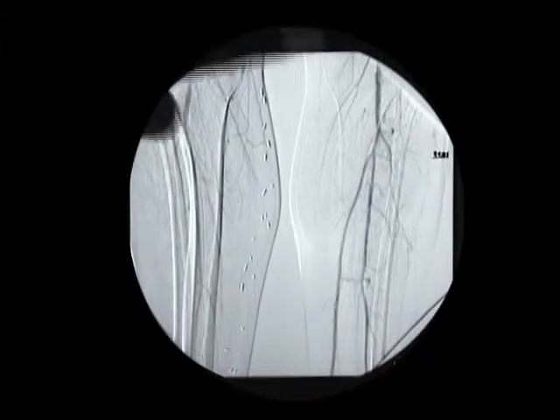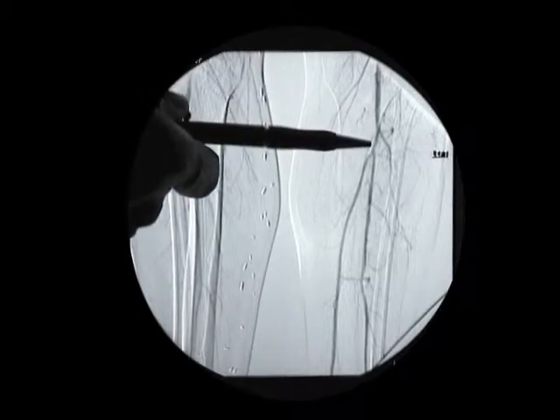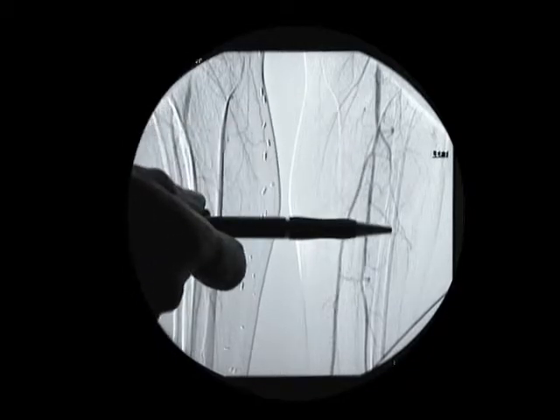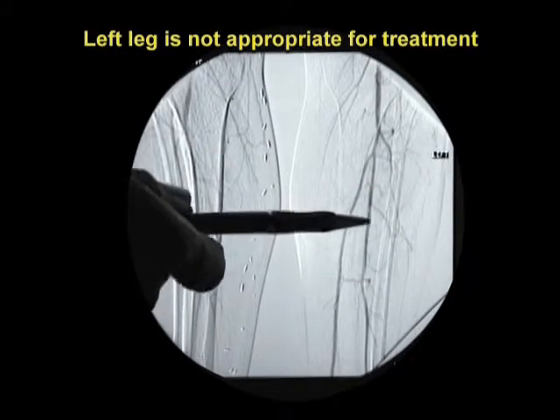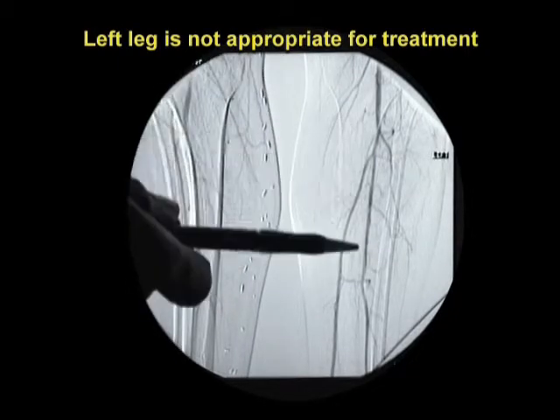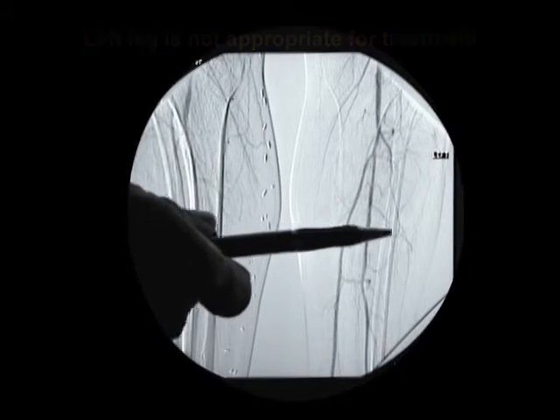On the left side, we see the below knee popliteal artery is of quite good quality. The tibial-peroneal trunk is patent, and there is nice two-vessel runoff through the peroneal and posterior tibial artery. The anterior tibial artery, however, occludes. The anatomy seen on this left side would not typically be appropriate for inclusion in this trial, as a femoral to below knee popliteal bypass would be a standard revascularization option.